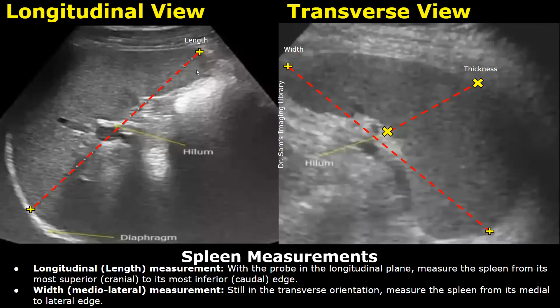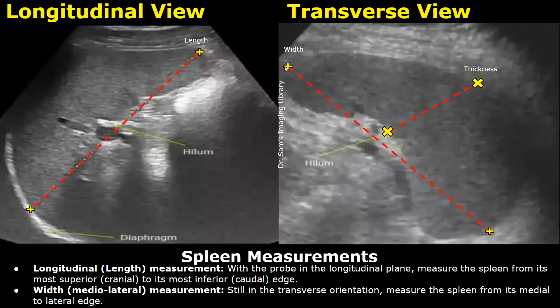After that, you can rotate the probe to a transverse orientation to measure the width and thickness of the spleen. To measure the width, place one caliper at the medial edge of the spleen and the second caliper at its lateral edge, and you can obtain the width of the spleen. These are the medial-lateral measurements.